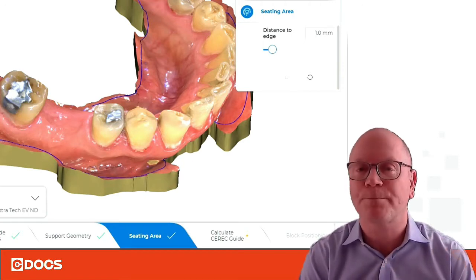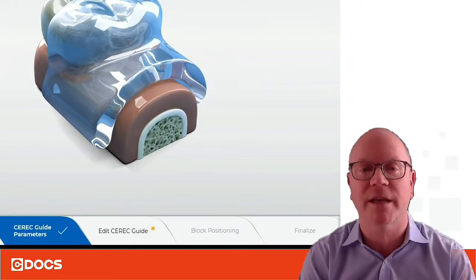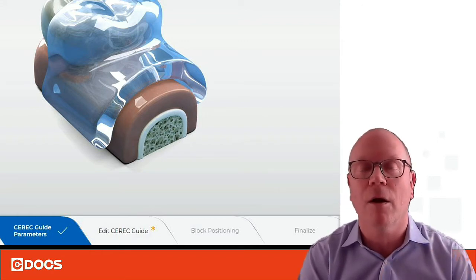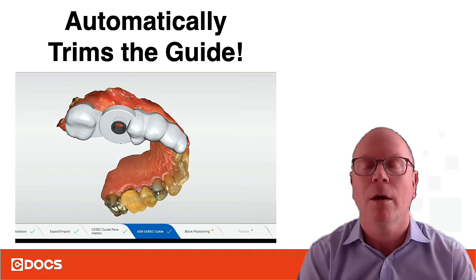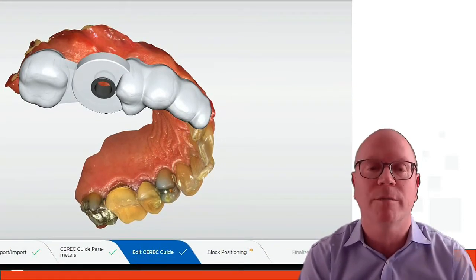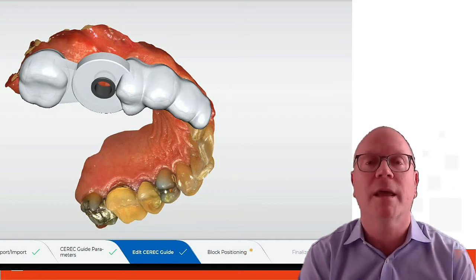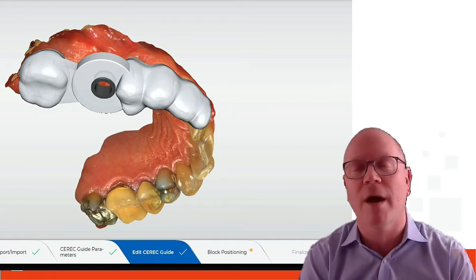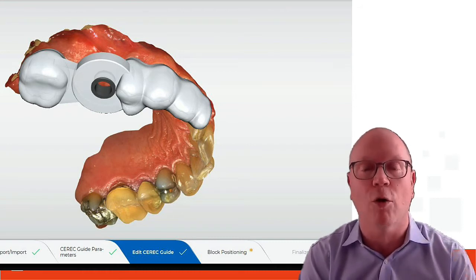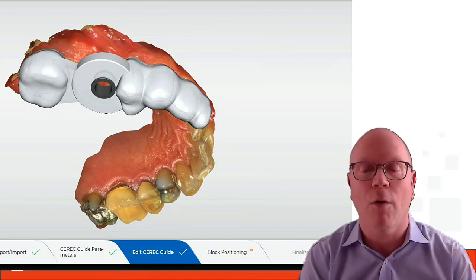Now when you first bring that in from the CMG DXD and you get through the guide positioning where you have to do the parameters, it automatically gives you an initial proposal and automatically trims the guide. As you see here, the guide comes automatically trimmed — you don't have to worry about how big it is compared to your block or where the over extensions are. You go right from there to block positioning, finalize, and then you can go ahead and mill it. So this is a great advancement.